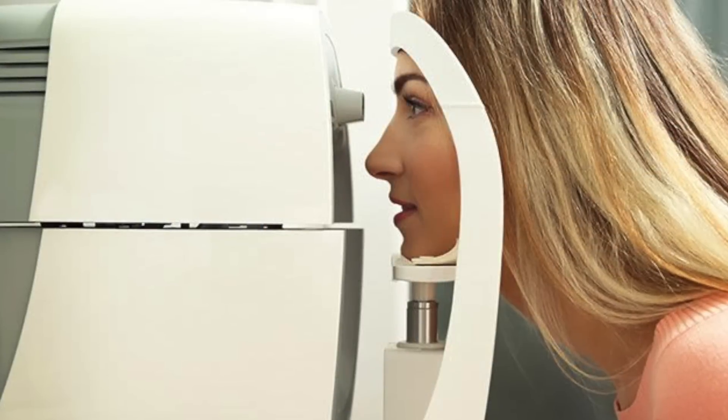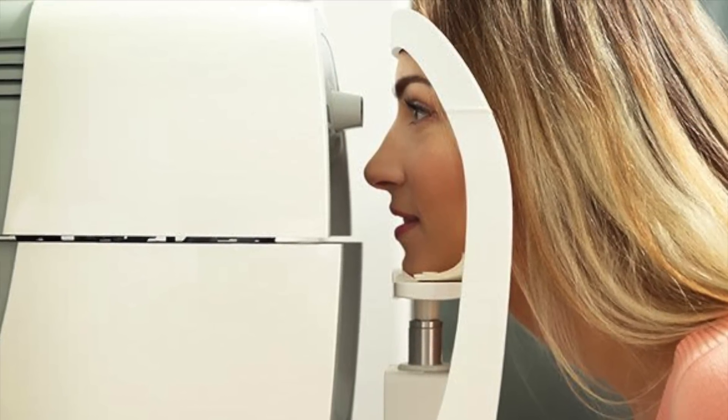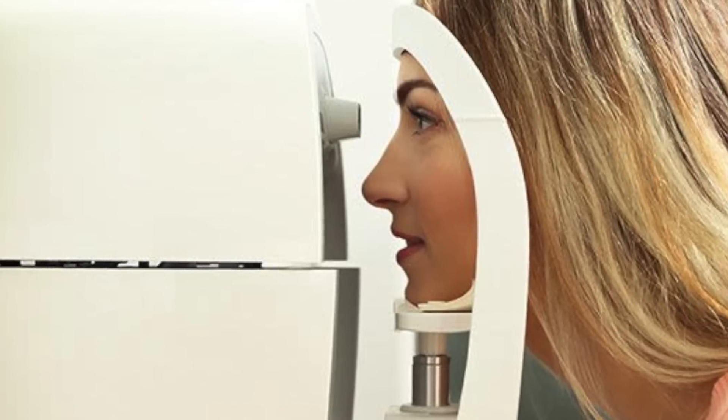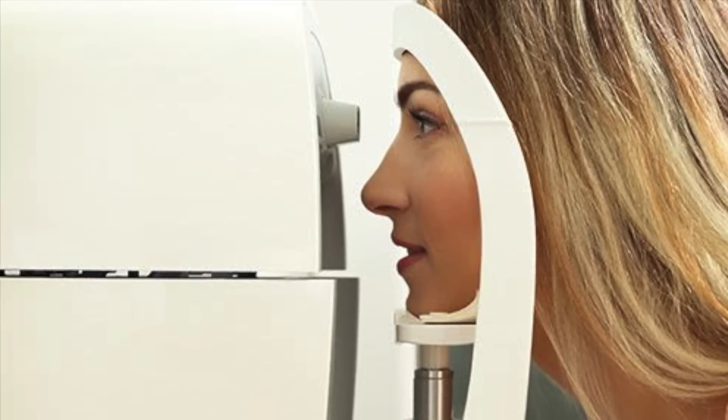The form of tonometry most people are probably familiar with — if you visit an optometrist regularly — is non-contact or air puff tonometry, in which a burst of air is fired into the eye and optical sensors determine the pressure at which the cornea is flattened. Air puff tonometry is less accurate than other methods but is a more convenient, quick, and less invasive means of pre-screening. If preliminary results are a little higher than normal, an ophthalmologist will typically follow up with a more invasive but accurate tonometry method.